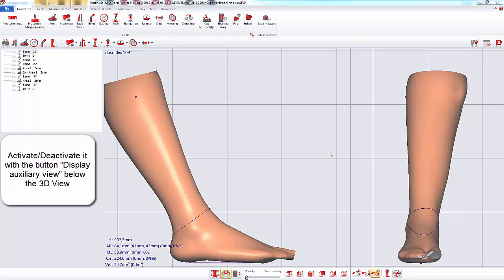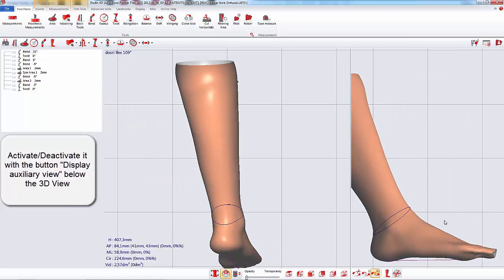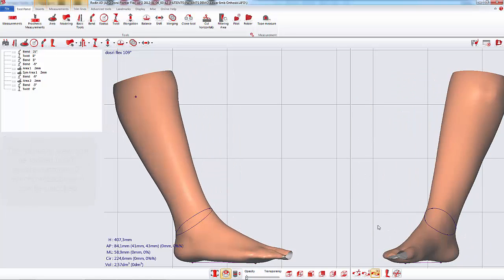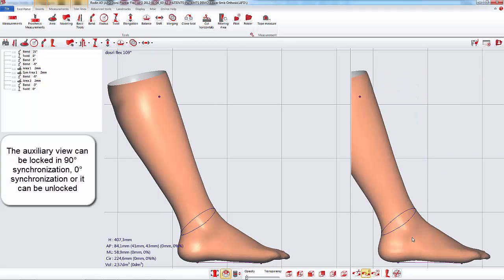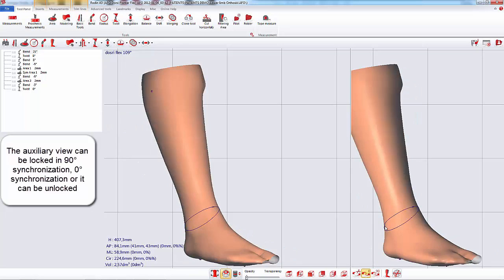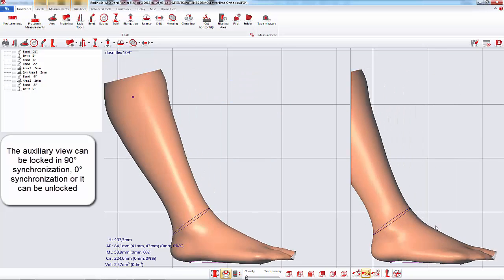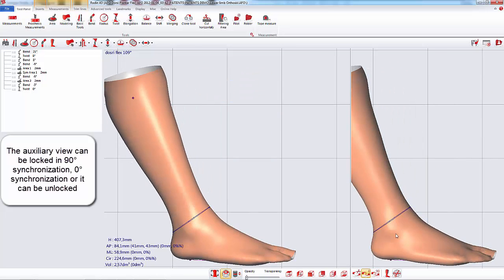The auxiliary view can be locked in 90 degrees synchronization, 0 degrees synchronization, or can be unlocked.